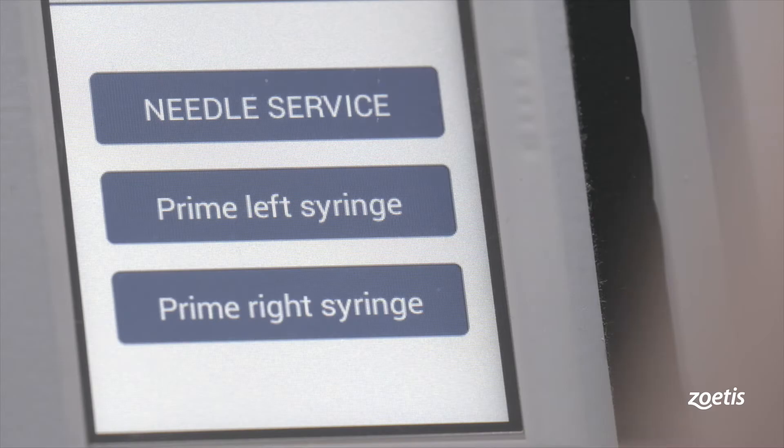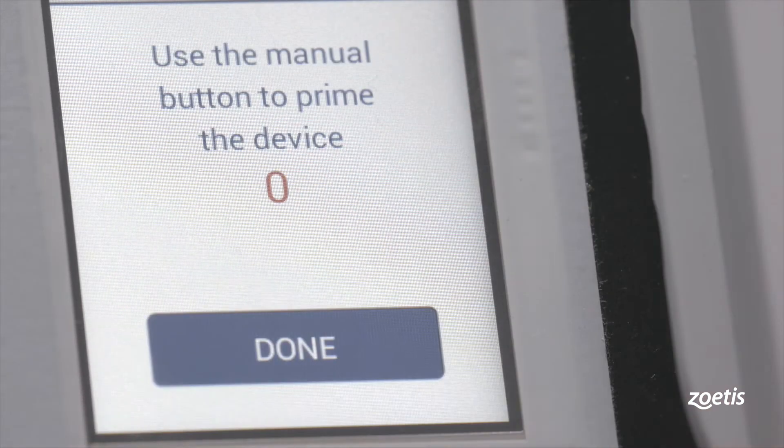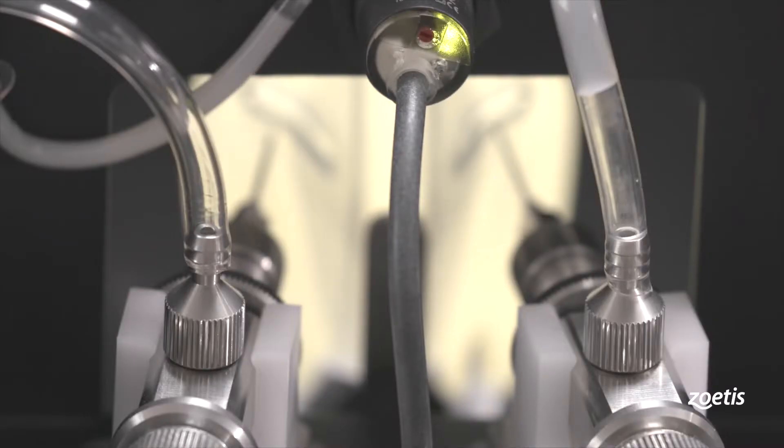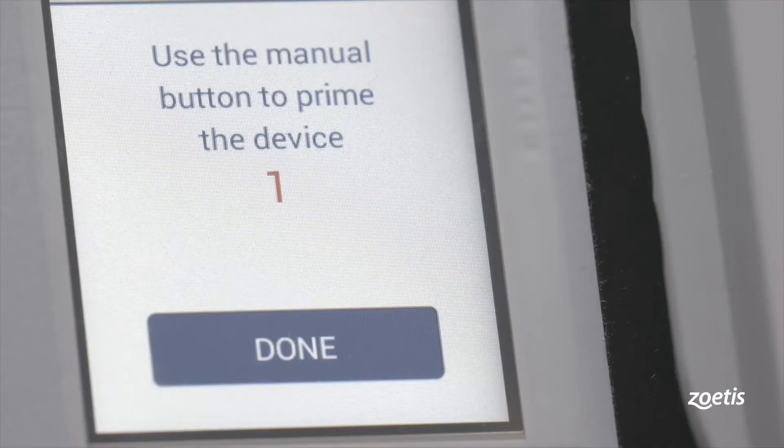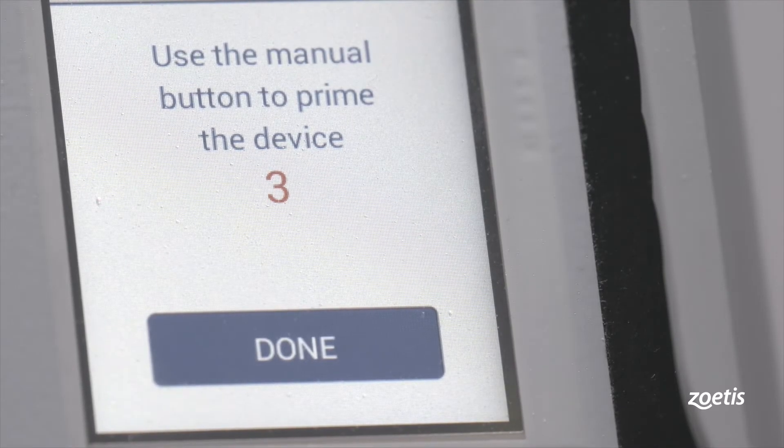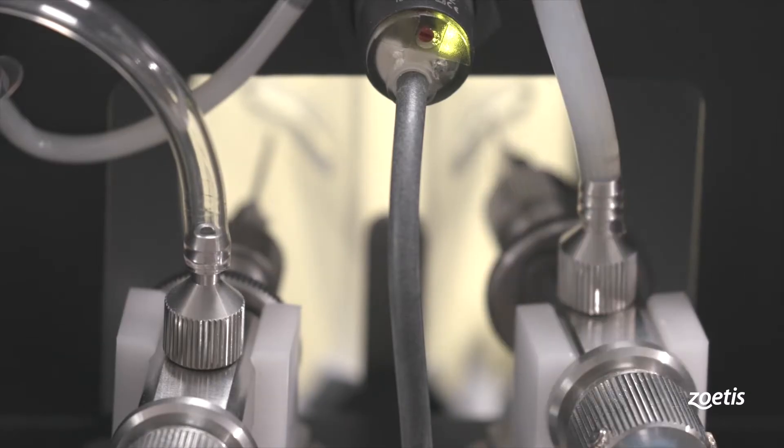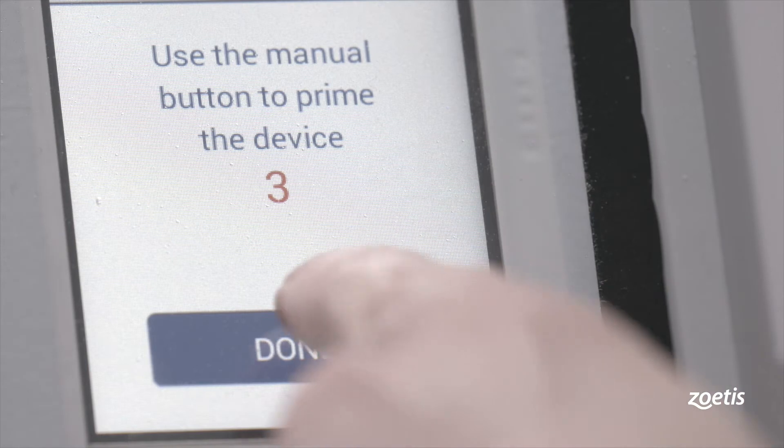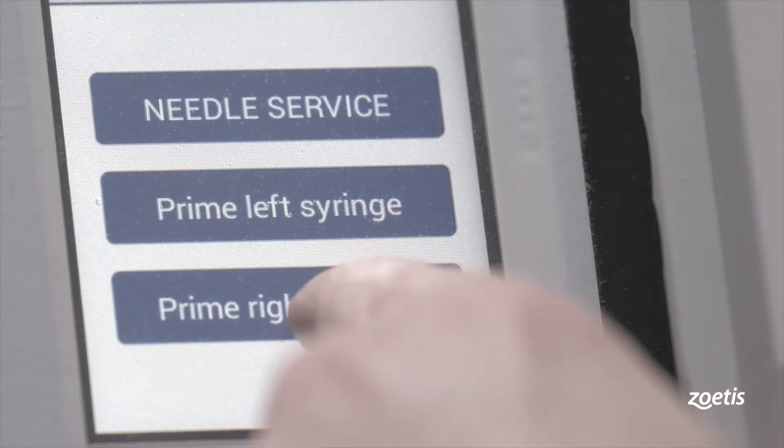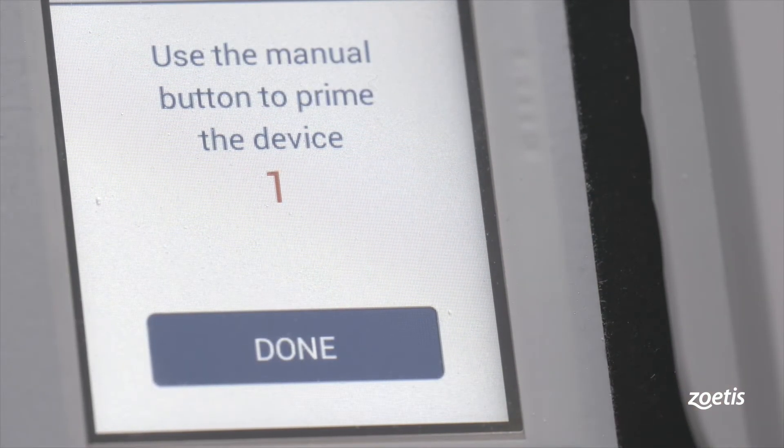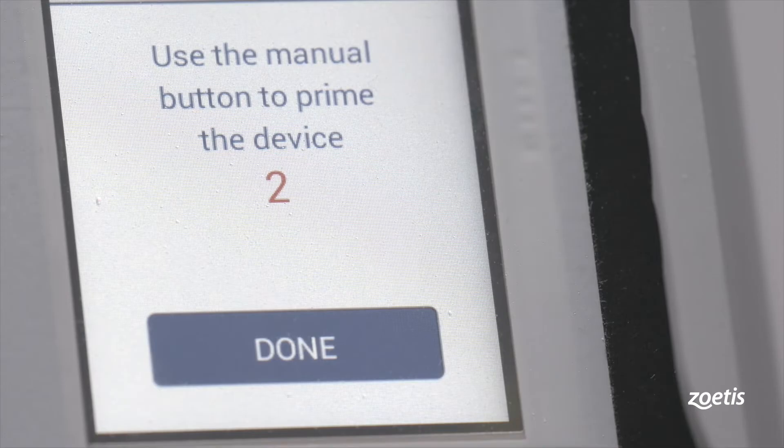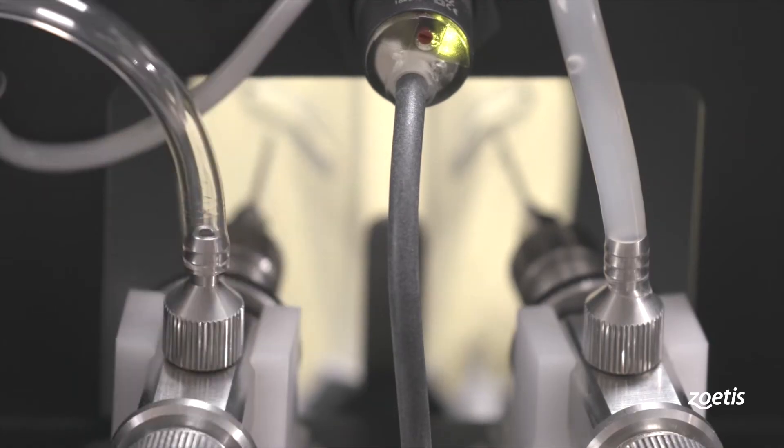Touch Prime left syringe on the screen. Push the manual button to simulate one injection and repeat this step until the syringe is primed. Touch Done to return to the setup screen. When working with both syringes, repeat this action with the Prime right syringe function as well.